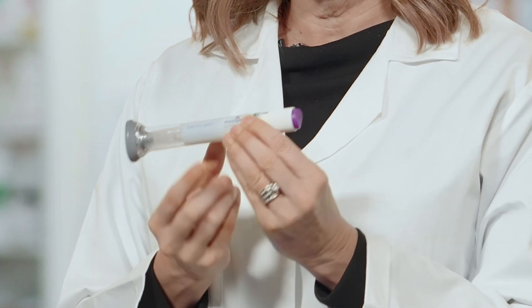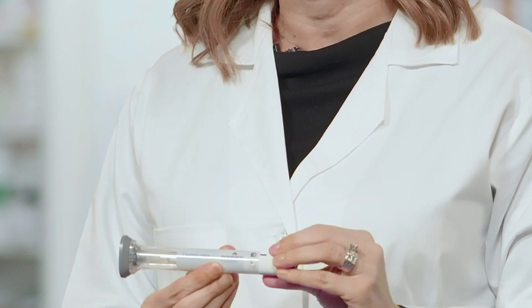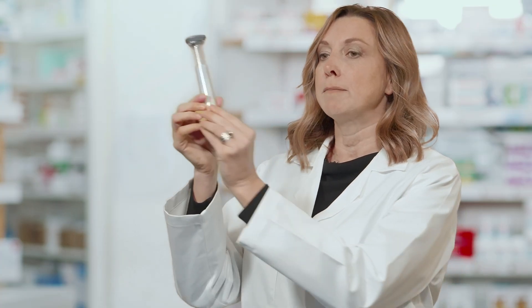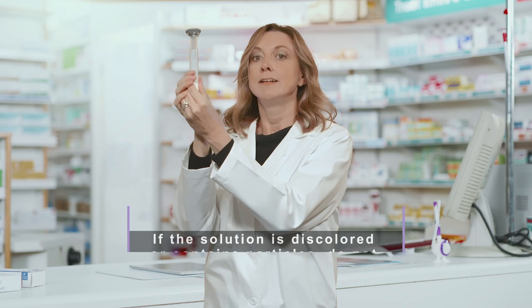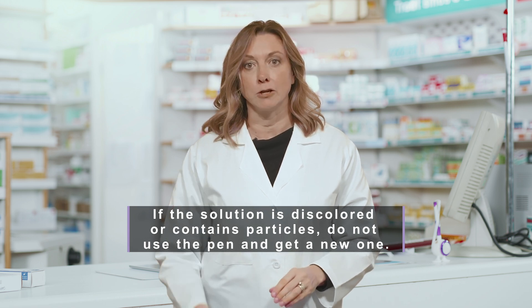Read the label and expiration date to make sure you have the correct medication and that it is not expired. Inspect the medication to make sure it is not cloudy and does not contain particles. If the solution is discolored or contains particles, do not use the pen and get a new one.